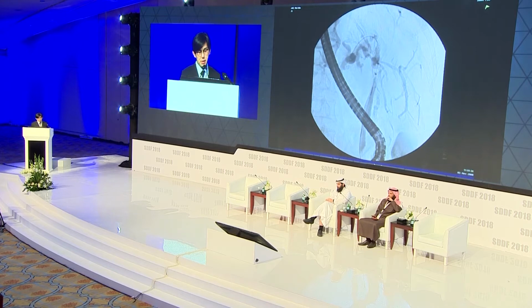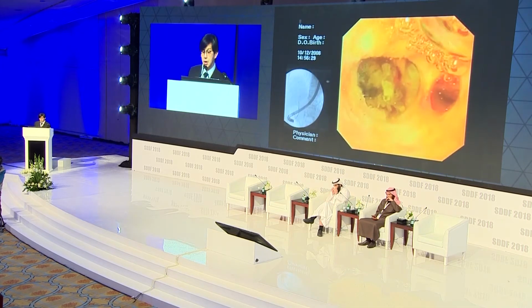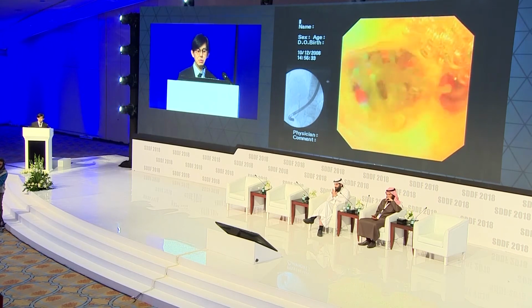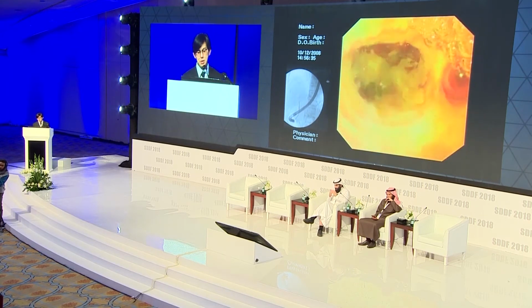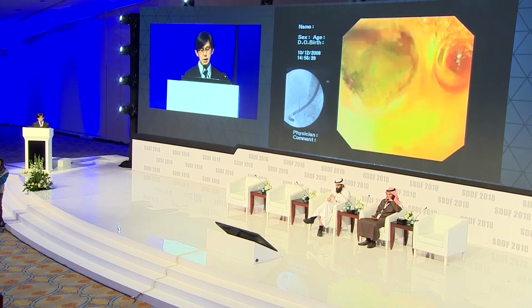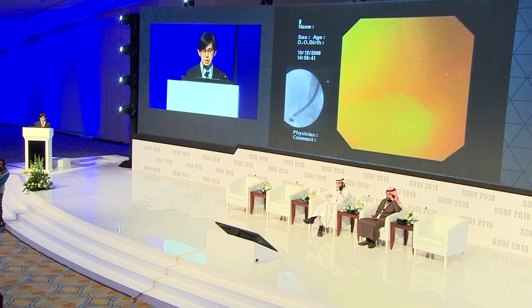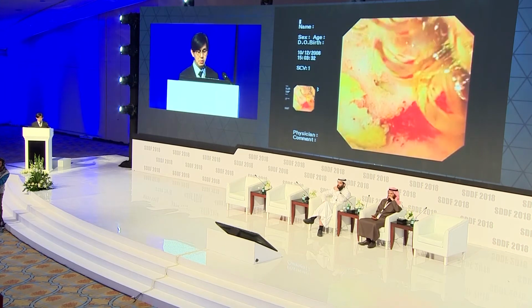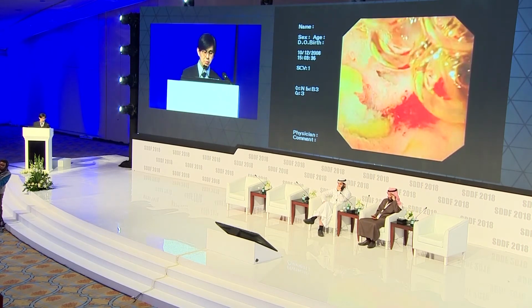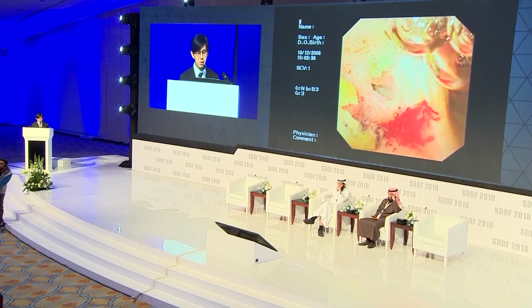Play the video, please. This is a case where we use the SpyScope for evaluation. This is actually a digital video scope. In our locality, we see a lot of recurrent pyogenic cholangitis, and sometimes we are asked to evaluate intraductal strictures, and cholangiocarcinomas actually happen in 10 to 20% of patients with recurrent pyogenic cholangitis.